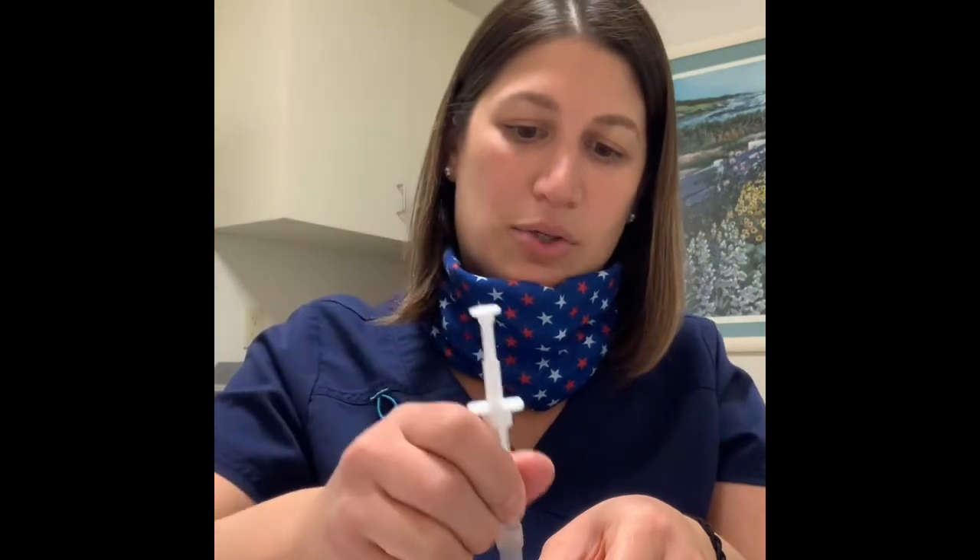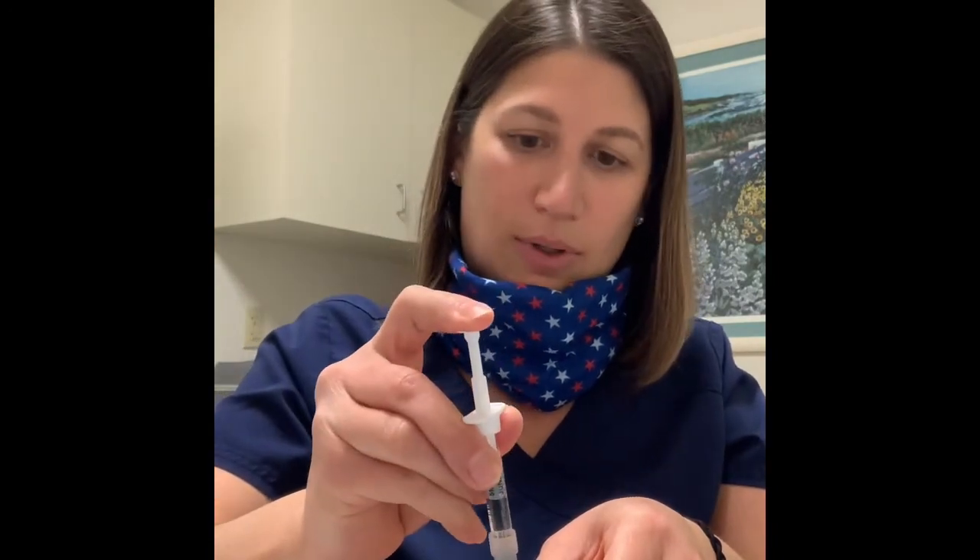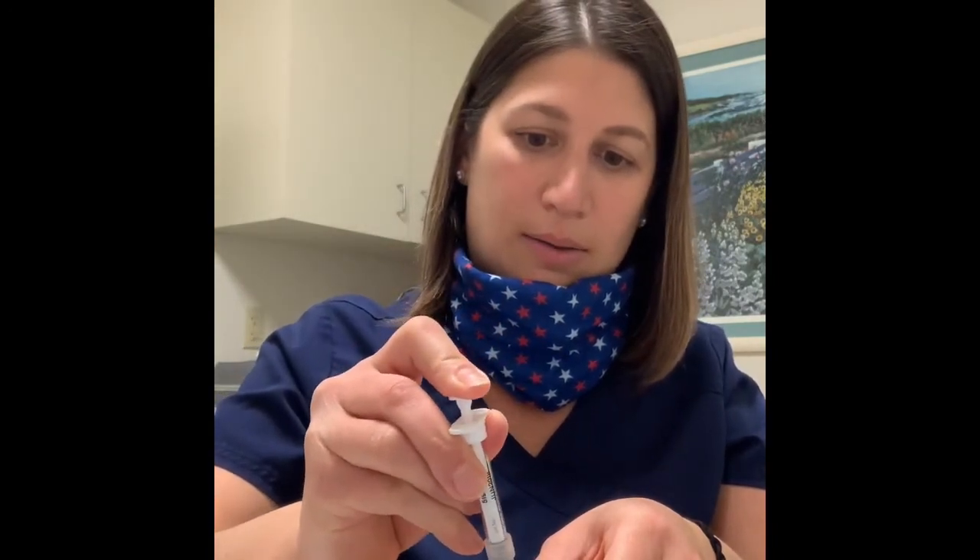Once you have the needle primed, make sure you have a clean area of skin — clean and dry. Pinch the skin, go straight in, inject it all in, pull it straight out, and throw the needle in the sharps container. You're going to get it.